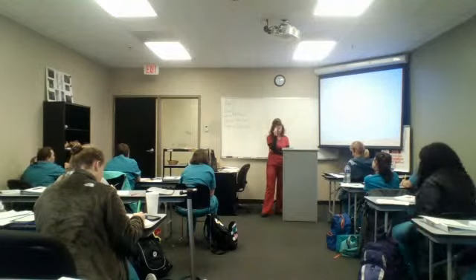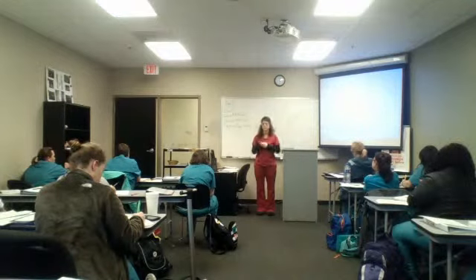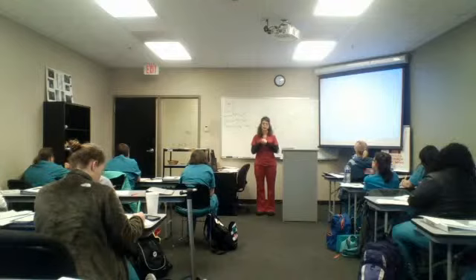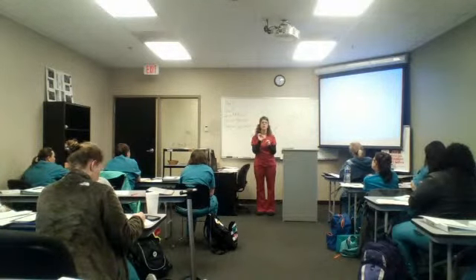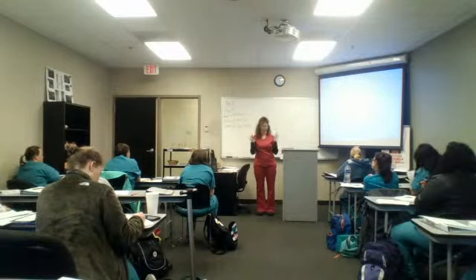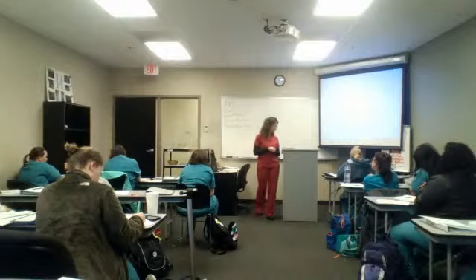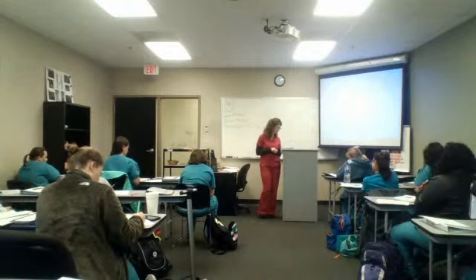All right, if you want to check for reflux in the deep system, in any system, there's a couple things you have to do. The first one is called augmentation. And I can't even say the word. Augmentation. There we go. A-U-G-M-E-N-T-A-T-I-O-N. Augmentation. That's the first thing, and I'm going to tell you what that means. Augmentation is your first step.